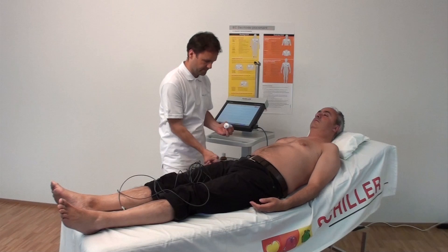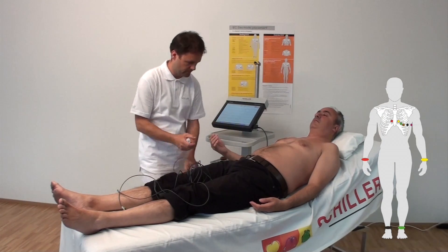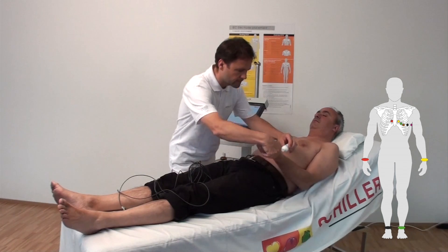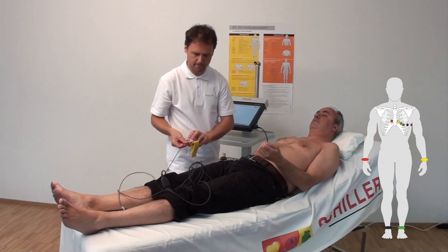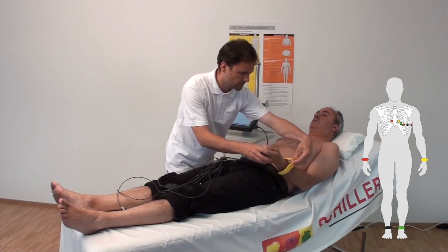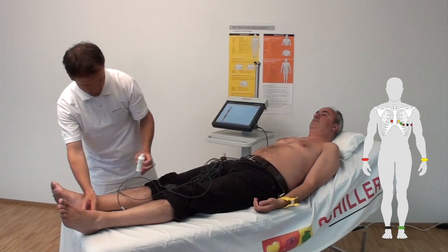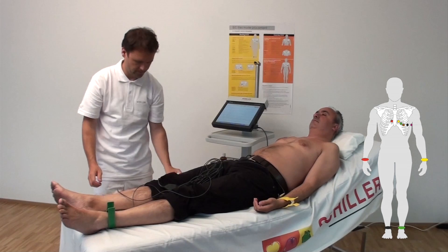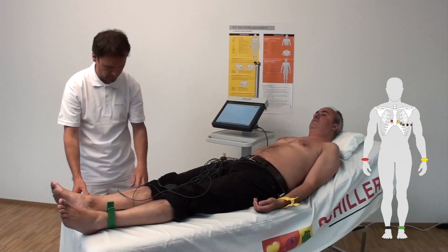Apply a thin layer of conductive gel on the skin and place the electrode on the patient. R — Red — right arm above the wrist. L — Yellow — left arm above the wrist. F — Green — left foot above the ankle. N — Black — right foot above the ankle.